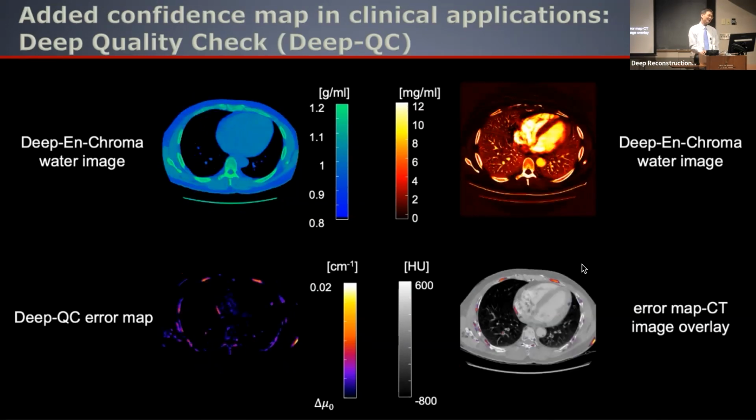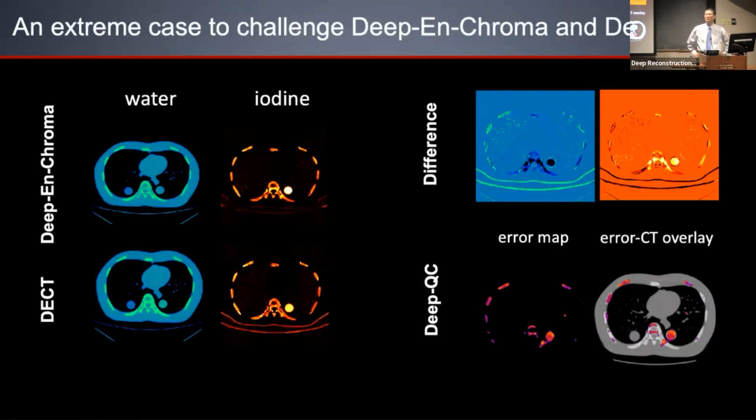Okay, and that is a good case. In another case, for example, it misdiagnosed some of the calcium and so on. Then you just tell AI to overlay that, so, okay, this part don't trust. That's it. And then you say, okay, in the end, what else can you do? I always want to challenge my team members and the students.